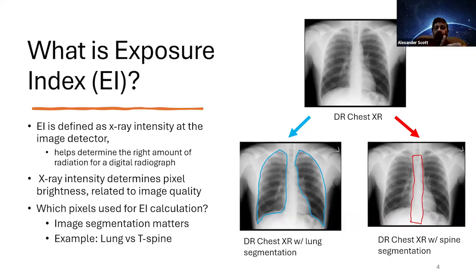I'm not a professional in that area. I don't take radiographs of people. I take phantom pictures, and they're much more compliant and they never complain. But I would say that looks properly exposed. But if we were doing a T-spine, as I have circled in red, there's not a lot of information there.